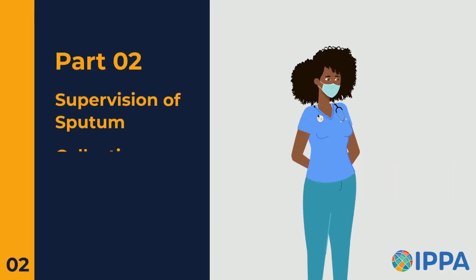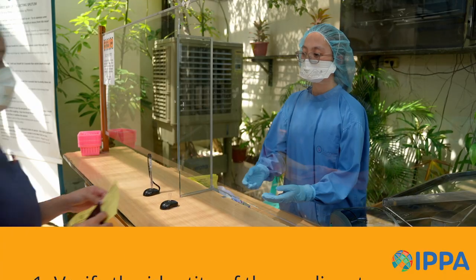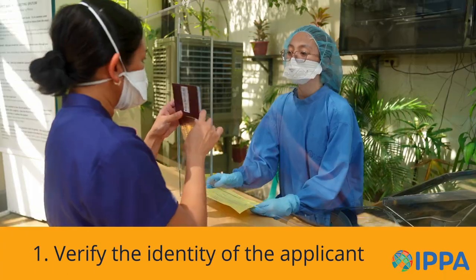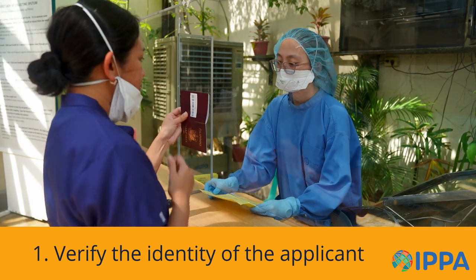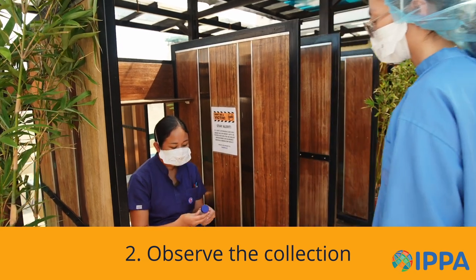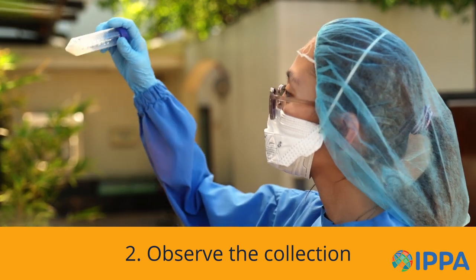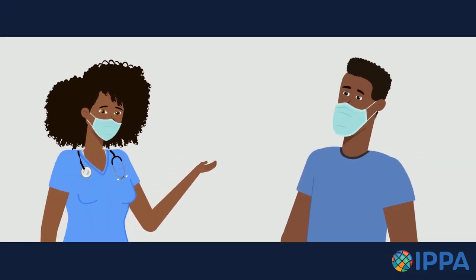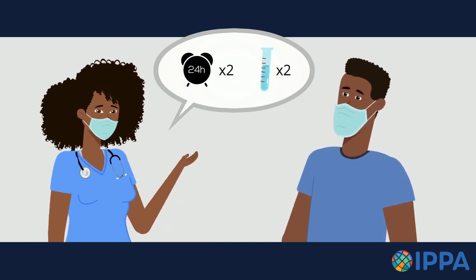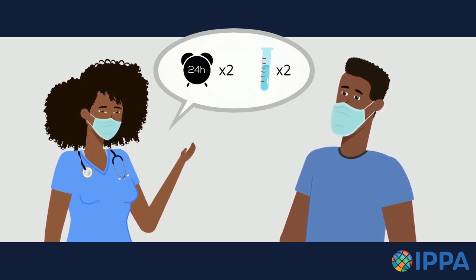Next, supervision of sputum collection. The staff should do the following. 1. Verify the identity of the applicant providing the specimen. This may require the applicant to remove their mask for photo identification checks. 2. Observe the collection to ensure they are not providing a synthetic specimen or tampering with their own specimen. 3. Explain to them they will need to come to the clinic on 2 more consecutive days to provide another sputum specimen. Verify their identity on both subsequent days.